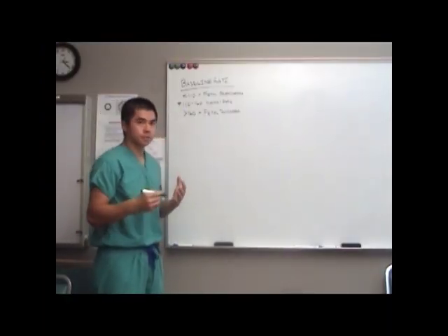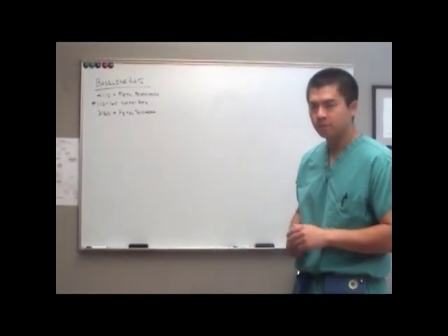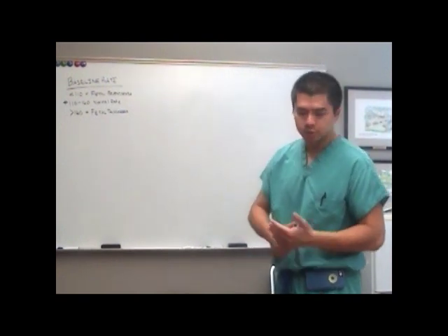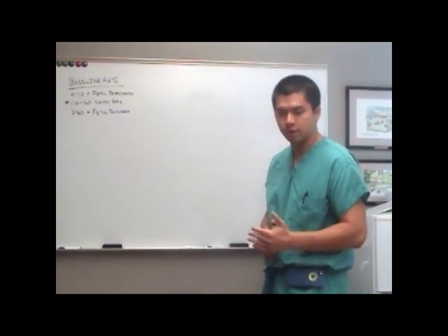Now, let's take a moment to look at the scale on our fetal heart trace. If you look at the screen, you'll notice that there's an area that's highlighted blue. Is this area the normal area? Nope, it's not. It highlights 100 to 160. Some people don't notice that, so keep that in mind. Between 100 and 110, that's still fetal bradycardia. Just because you see that it's in the blue doesn't mean that it's normal. That's just on our screen. So normal is between 110 and 160, not just the blue that's on our screen.